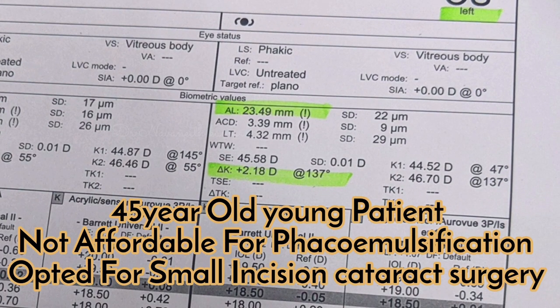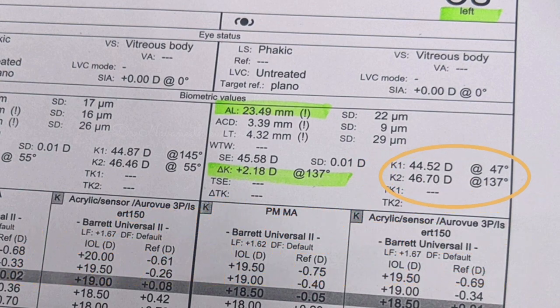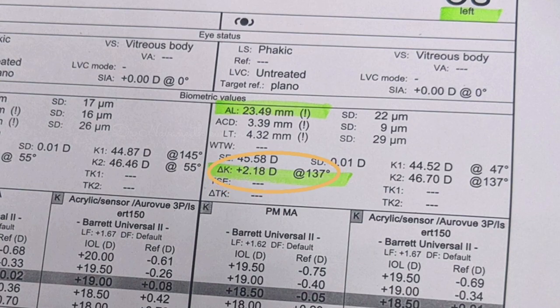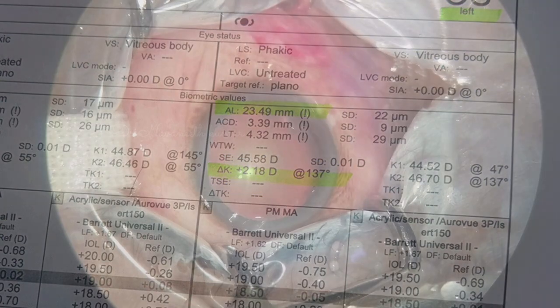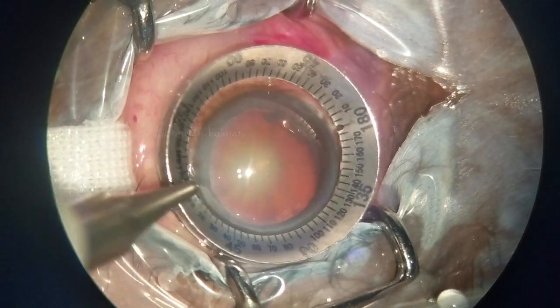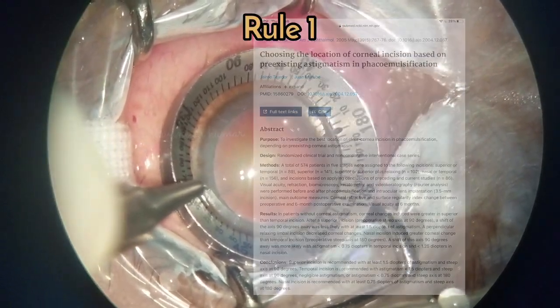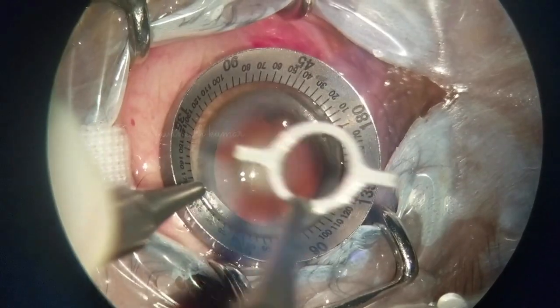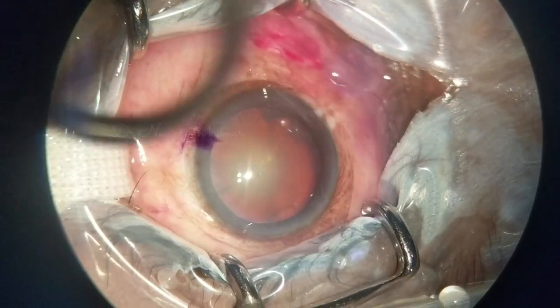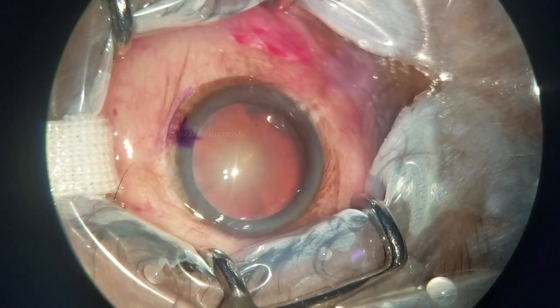Here is a 45-year-old patient who opted for small incision cataract surgery, with the steeper meridian at 140 degrees requiring two diopters of flattening. Rule number one is to place the incision at the steeper axis. Here it is placed at 140 degrees, marked with the help of a toric marker in the infero-temporal plane.